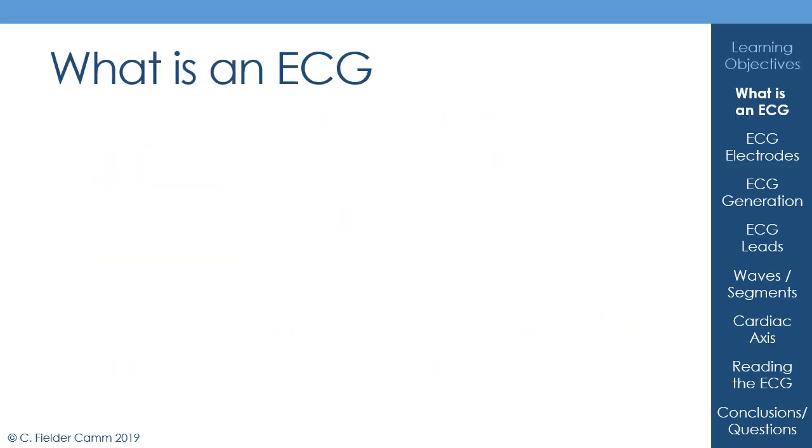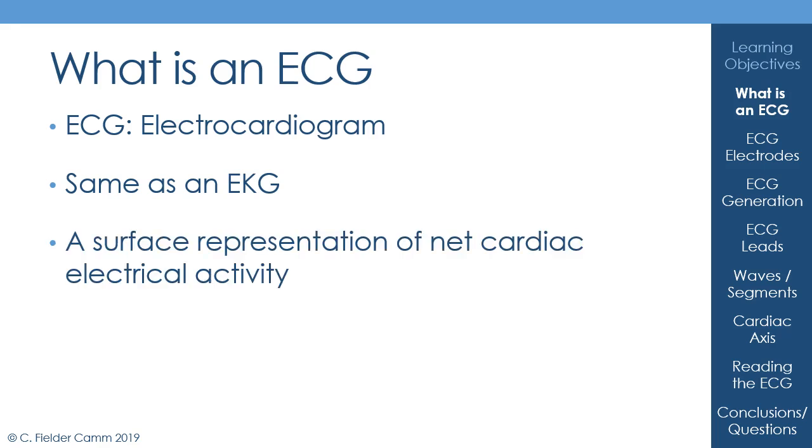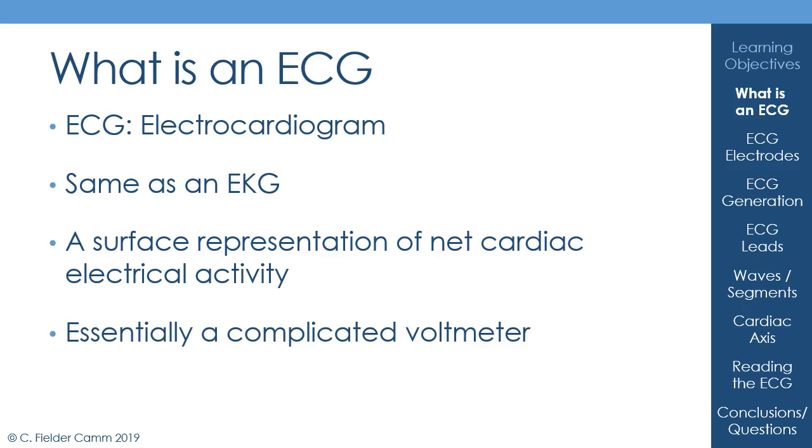So what is an ECG? Well, ECG stands for electrocardiogram. It's the same as an EKG, if you ever hear that being talked about often on American TV shows. And essentially it's a surface representation of the net cardiac electrical activity. And this makes it essentially just a complicated voltmeter. But it can seem like a dark art interpreting an ECG.